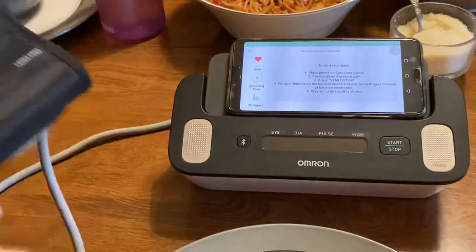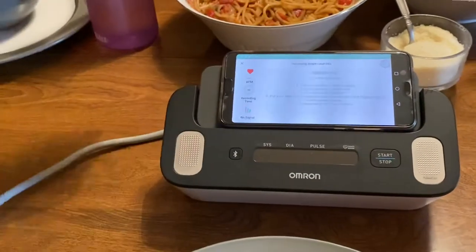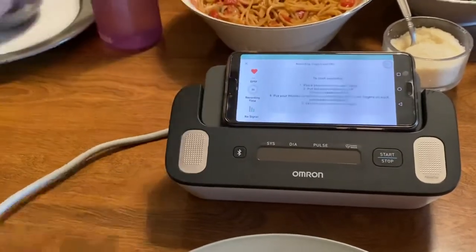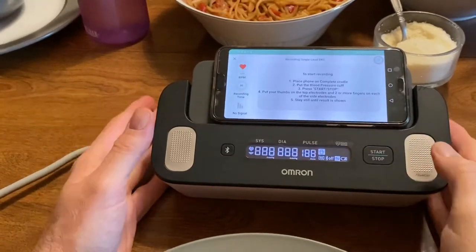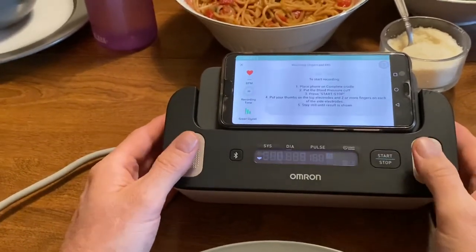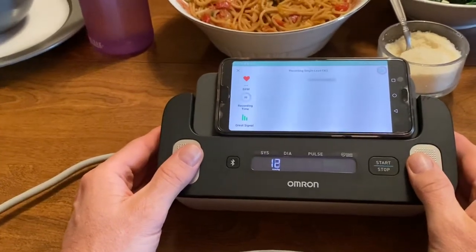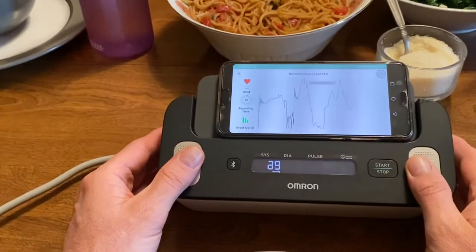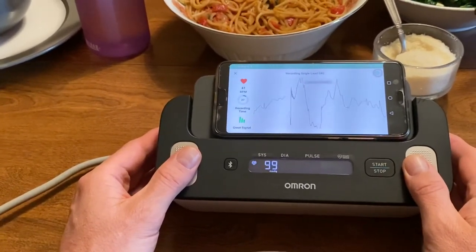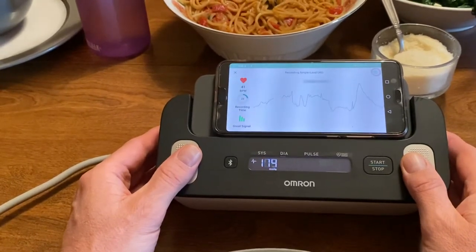It tells me what I'm supposed to do next. I need to put on my band and I can do this myself, and then I simply press the start button. Once I press the start button, I make sure that my thumbs go on to the top and my other fingers on the side, and it's now going to start its reading.